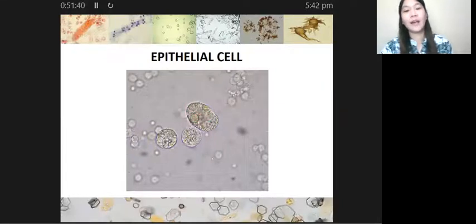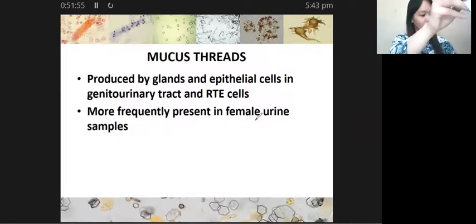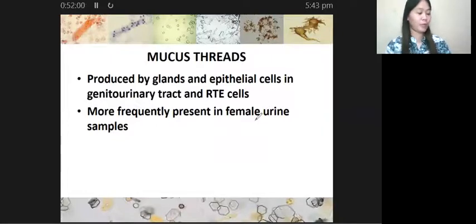Okay? So yan. So now let us move on to the other miscellaneous structures. Bali, inuna ko na yan. Okay? And then, ihuhuli na lang natin yung ating casts and crystals. Kasi medyo madami-dami sila. Okay, so yan. So mucus threads po muna tayo.